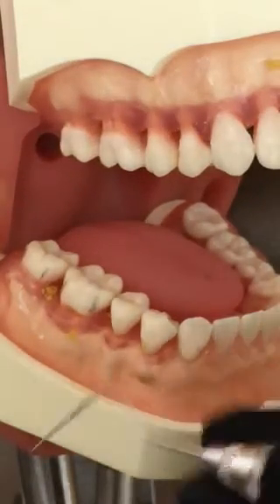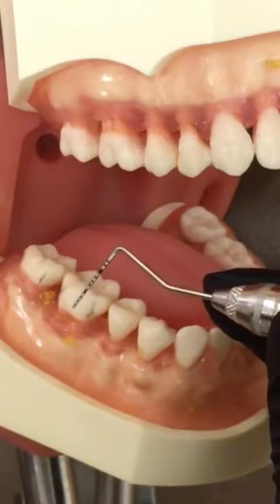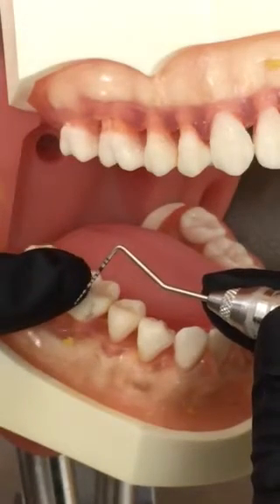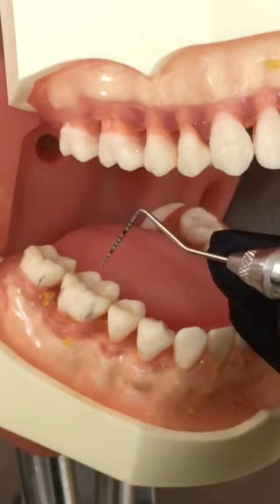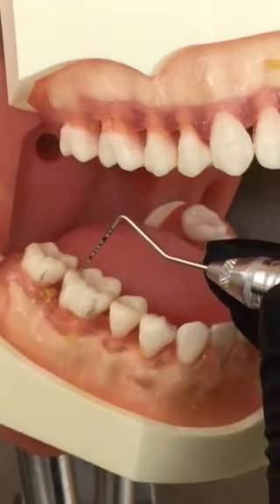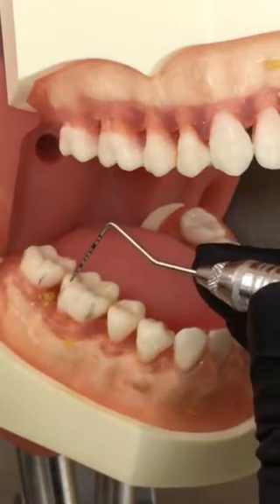The periodontal probe we use in the TJC clinic is calibrated in one millimeter increments, as you can see with the black markings. The lower part of the thick black bar represents four millimeters, the top represents five, and then you count six, seven, eight, nine, ten, and up from there. A good visual, especially if you're having a hard time seeing the smaller increments, is watching that thicker black band.